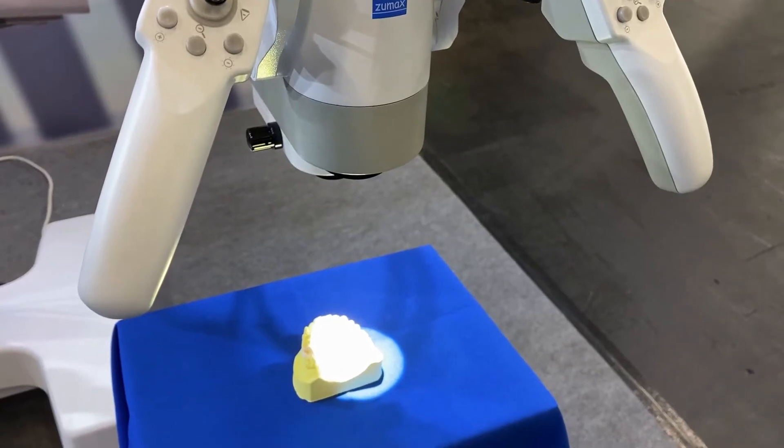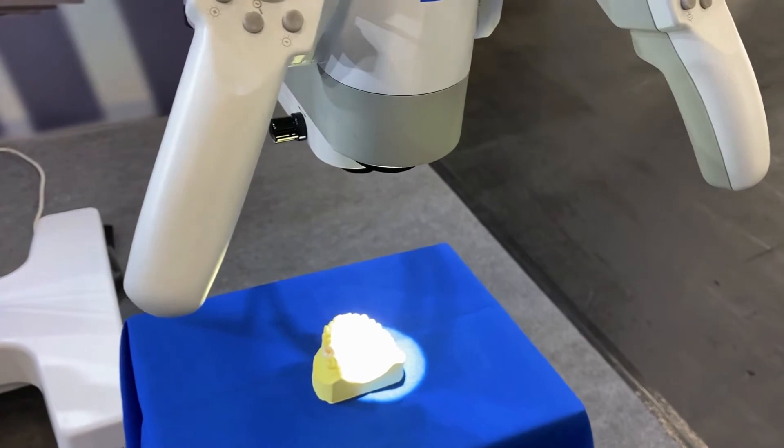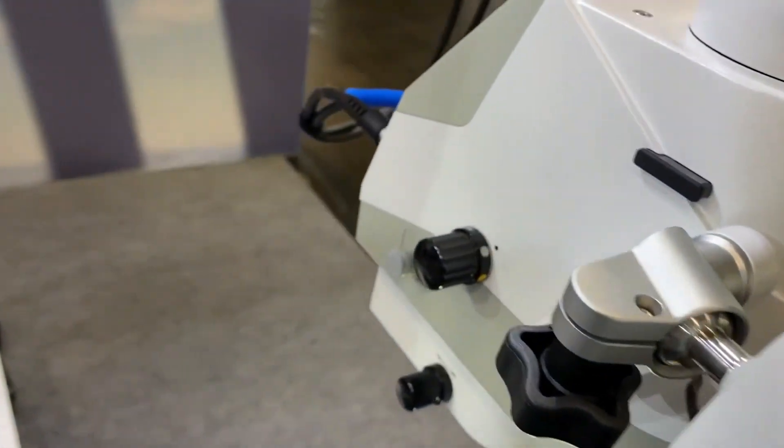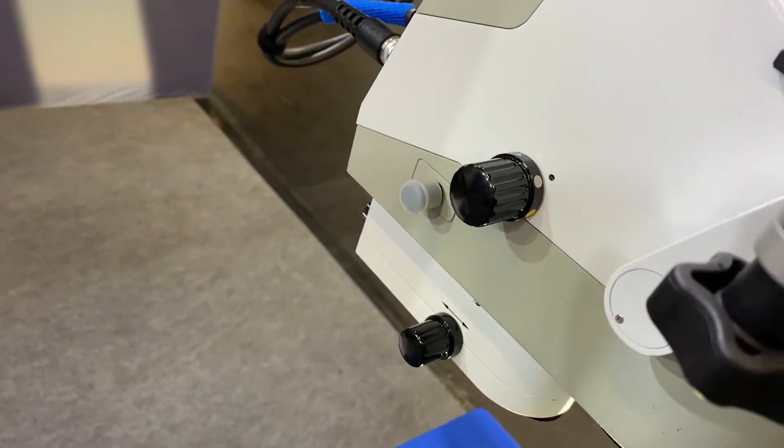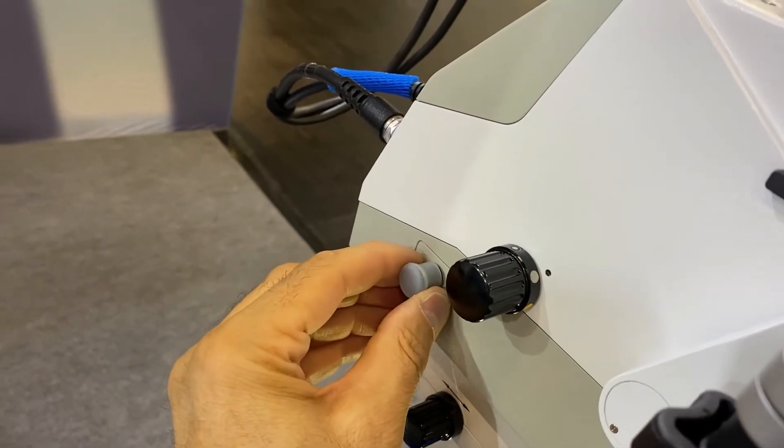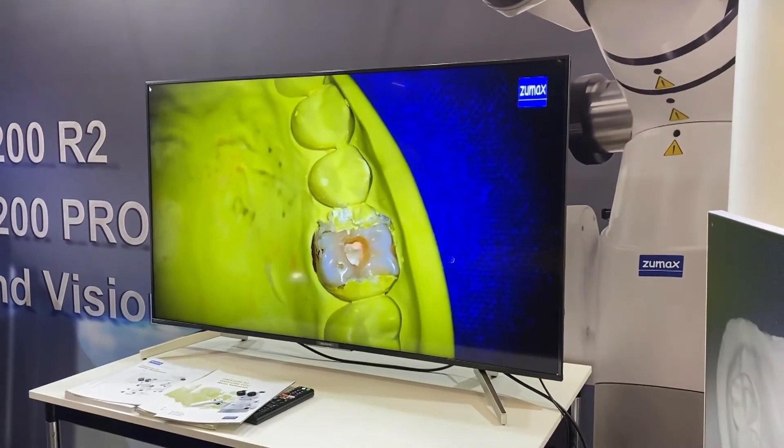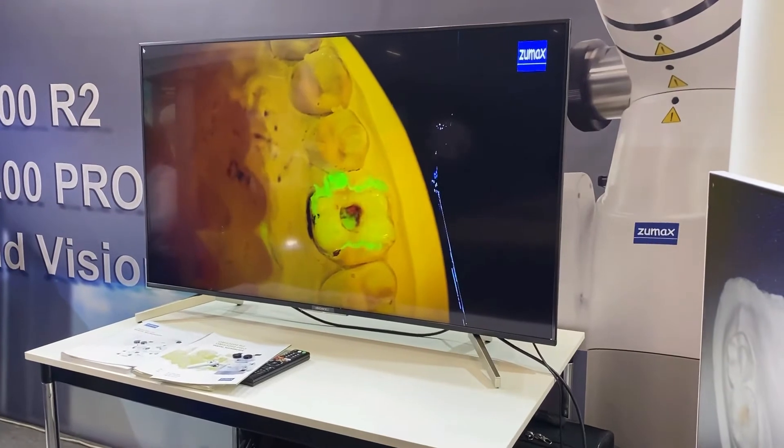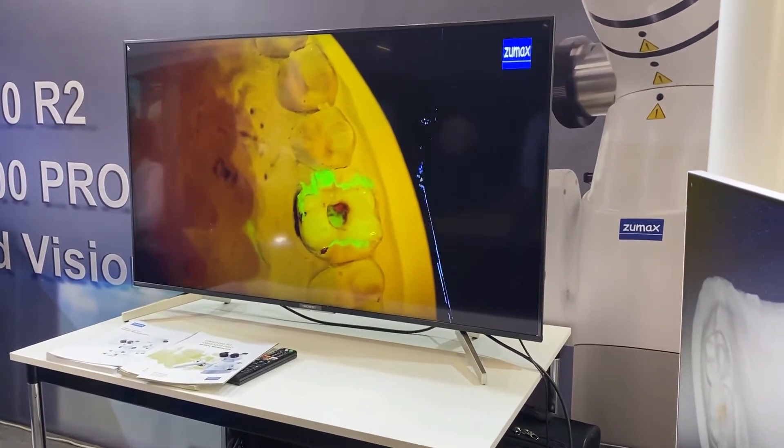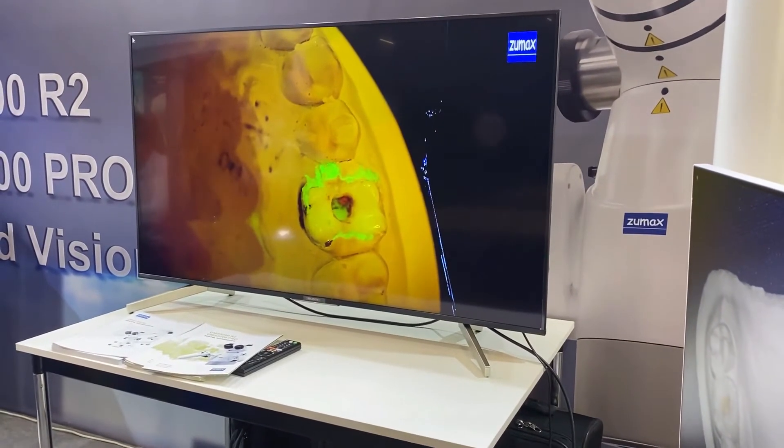This model comes with the optional fluorescent light for diagnostics. You will activate the light here on the side of the microscope with the switch here which I will pull out. Here is the screen. I pull out the switch and we activate the fluorescent light for better diagnostics of caries for example.